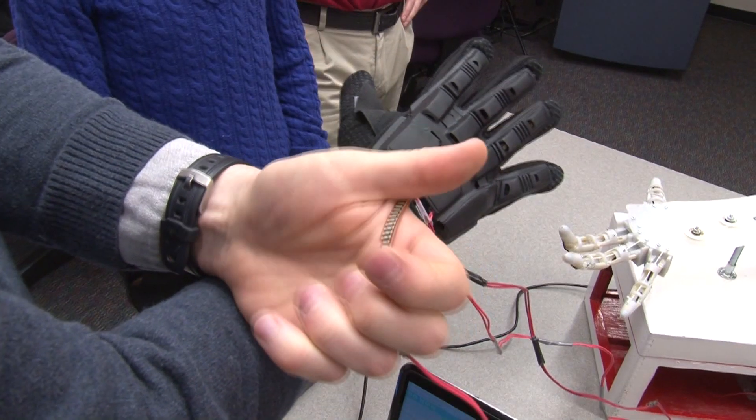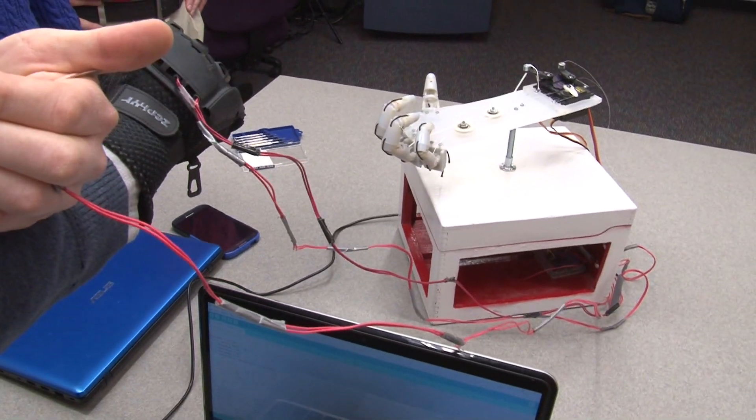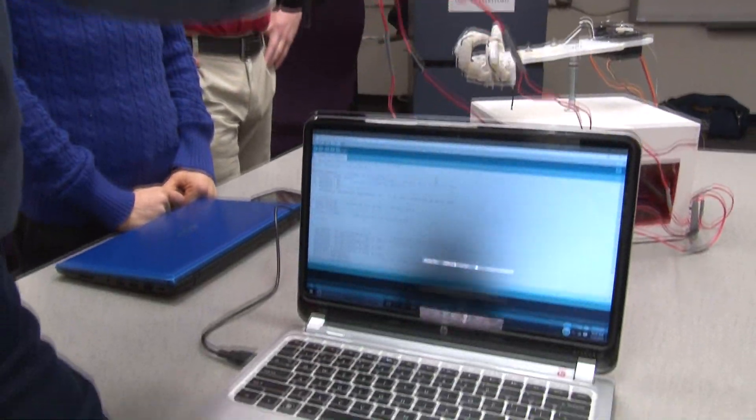We have a fully functional prototype now with three degrees of freedom, and by the end of the semester we hope to have a fourth degree of freedom. We also have a working prototype finger that can be expanded or contracted to meet the size needs of the patient.